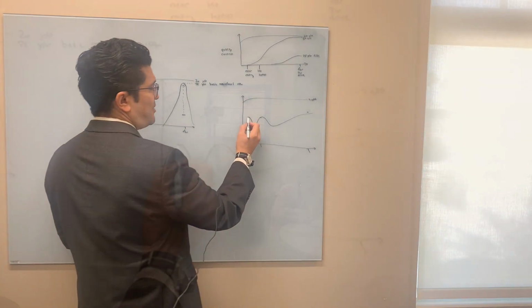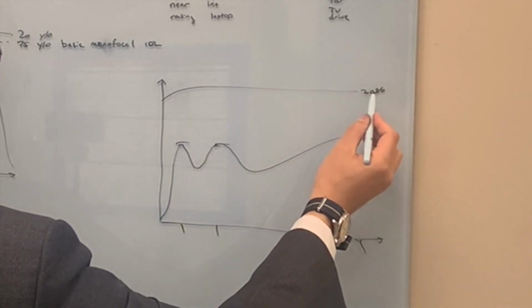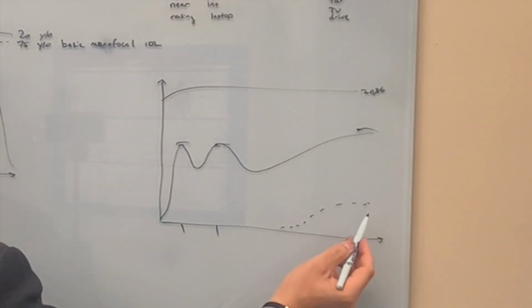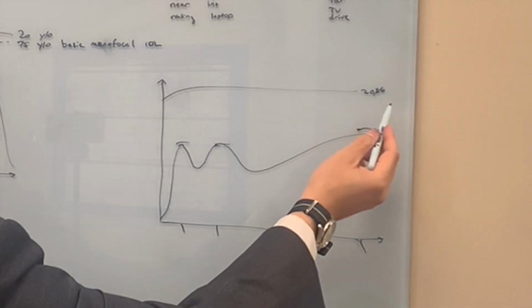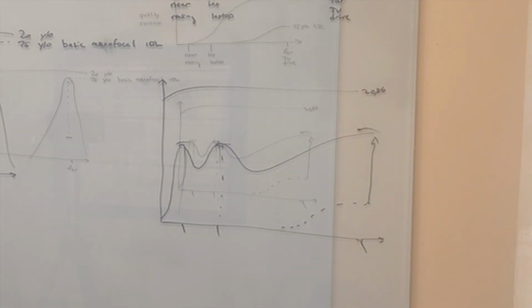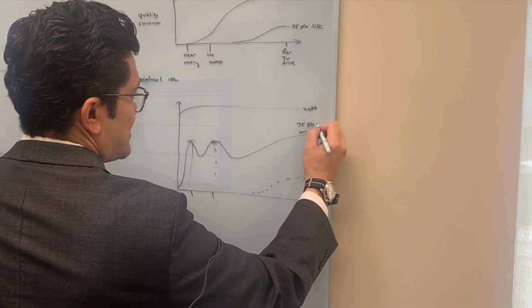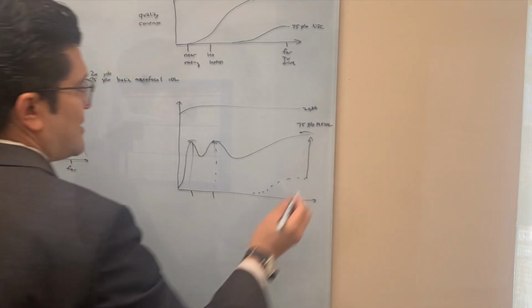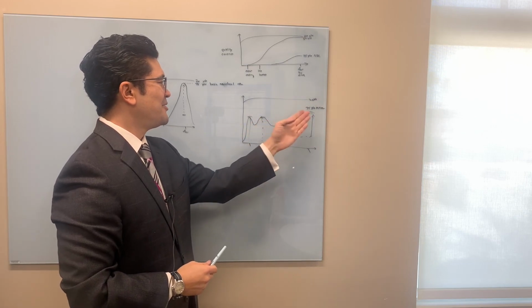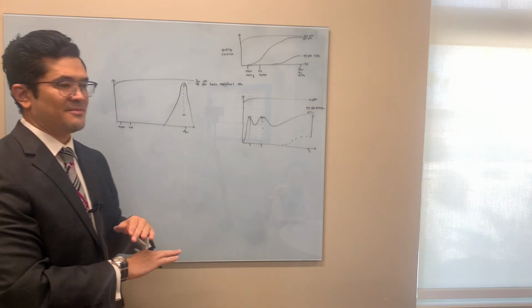And if you notice, each point maybe isn't, it's not to scale, but each point is not quite as good as a 20-year-old. But a lot better than when they started down here. Their original graph was like this. So they're going to have improvement in the distance, they're going to have improvement in the intermediate and the near. So your 75-year-old with a multifocal lens is going to love it. They're going to say, awesome, I see so well. I was here and I'm here. I was here, here, here, here. At every point along their defocus curve is going to be much better.